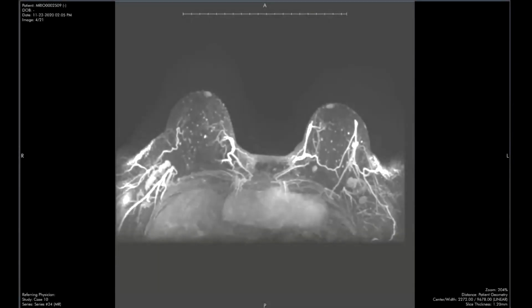So I'm going to shift gears here and talk about BI-RADS 3 on MRI. This is a tough topic because there's just really not that much data on it. And that's because in order to show that there's between a 0 and 2% chance of malignancy, you really have to have a lot of cases in the study. And we just don't have that many large studies of MRI.